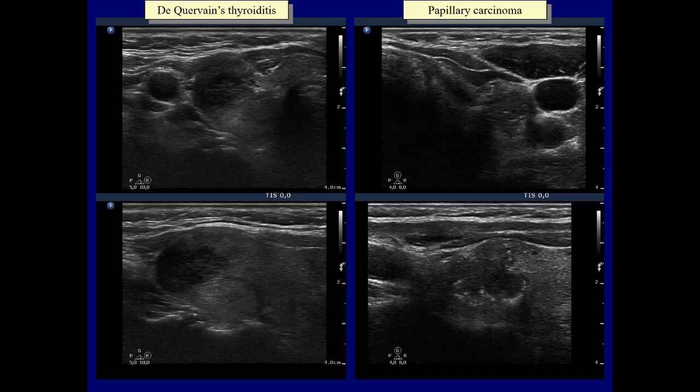The hypoechogenic lesion presents basically sharp but irregular borders, which is an unusual finding in thyroiditis. There are several minimally hypoechogenic areas in the case of thyroiditis. The presence of non-specific small hyperechogenic granules has no relevance in the event of an echonormal nodule. The surface of the tumor is lobulated. Note the presence of microcalcifications.